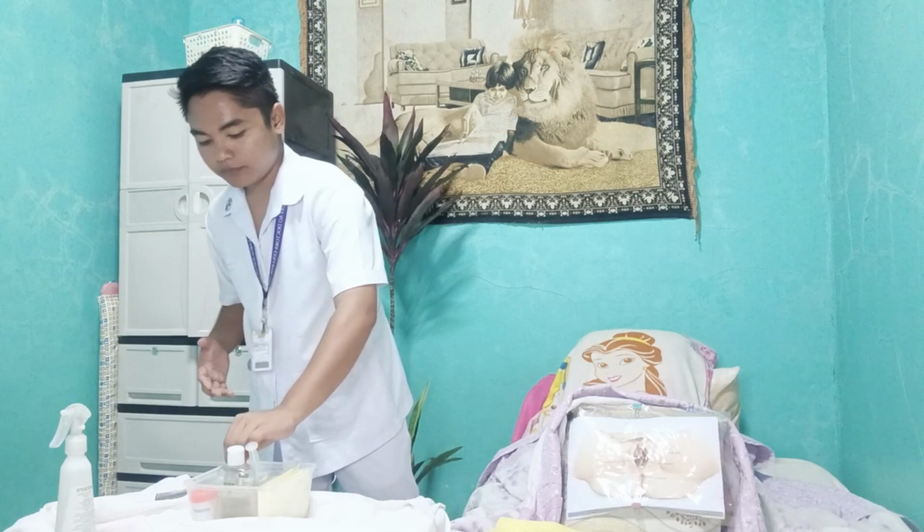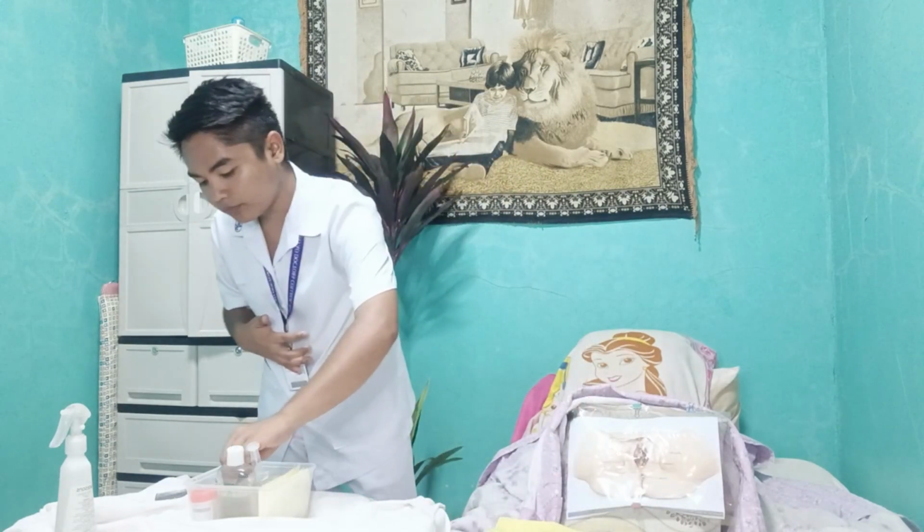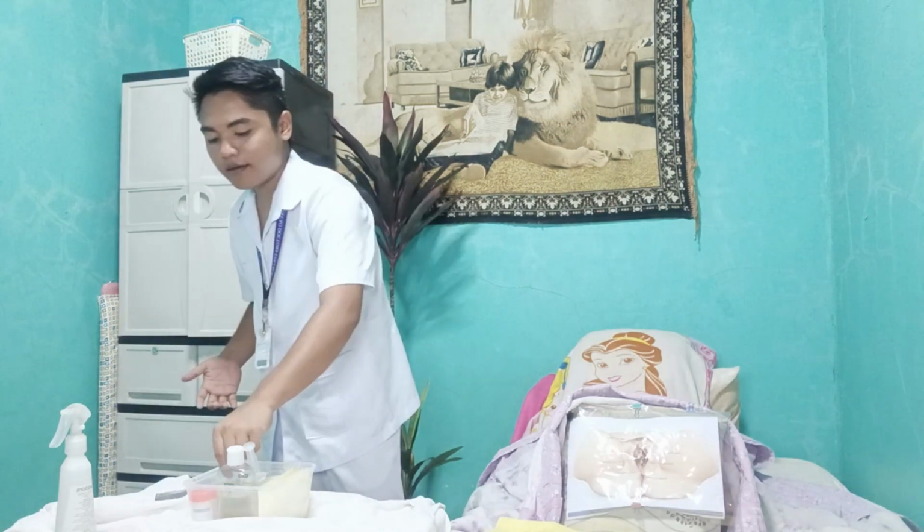So first, let's discard. Next, I am going to use another cotton ball for the labia majora. Remember to never retrace a stroke to ensure that we do not contaminate the cleansed area. Start. Now, let's proceed to the labia minora and then the labia minora on the opposite side.